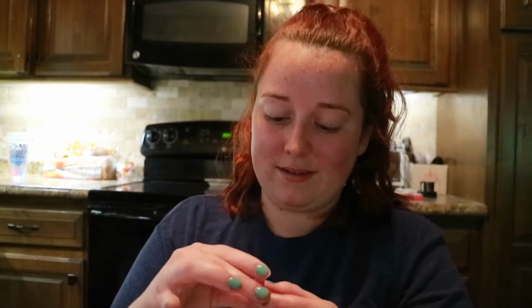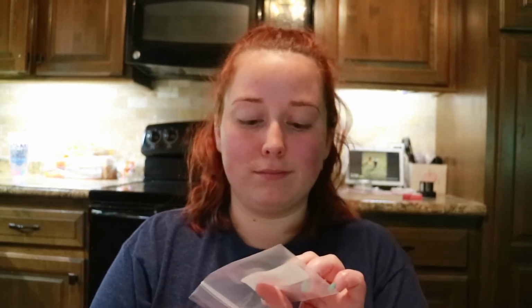Okay. No. Oh, thank God. It didn't open. That would have been bad. Well, now it's shook up just a little bit more. Good thing we got some extra blood in there. Okay, so we're gonna put this in here. Place container in the large bag, and the large bag says, place container bag with sample inside this bag.